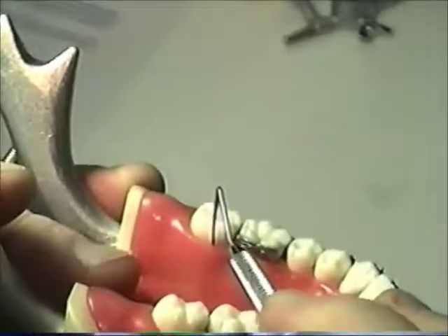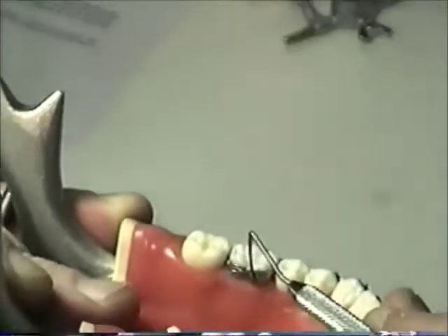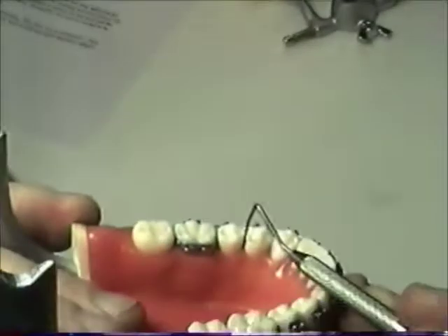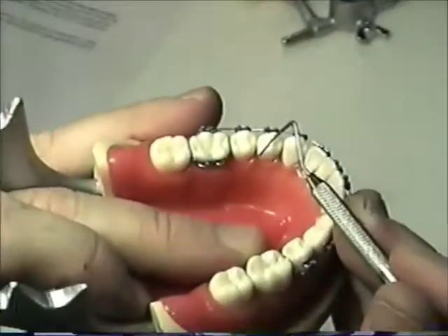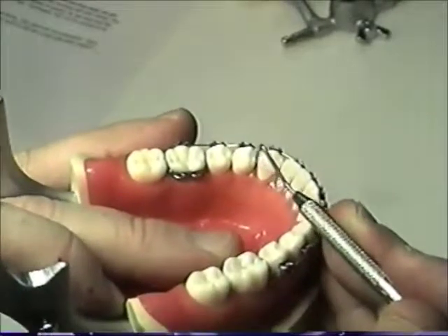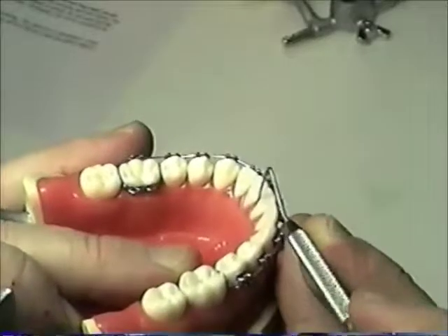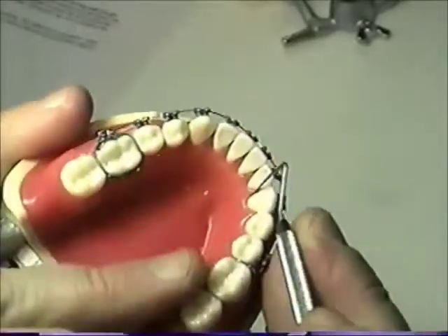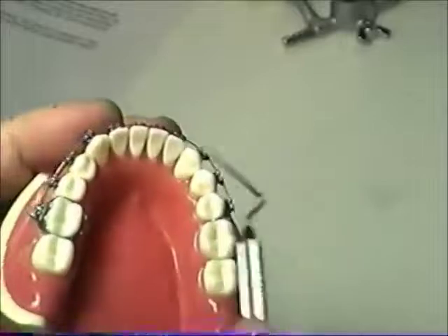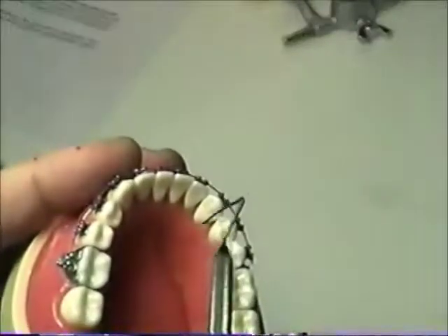When you're water picking, you actually see the probe, you can see it go down up under the gums, and then you follow all along here. You won't actually jam the probe of the water pick up under your gums, but you'll be outside, and you can feel the water streaming so hard, you can feel it like it's a probe going up under your gums. And all around. Notice when you water pick, you should start on one side, just like I just did, and keep going all the way around.